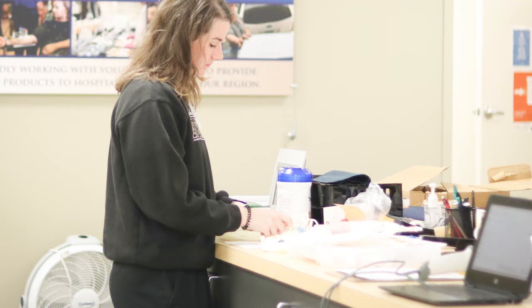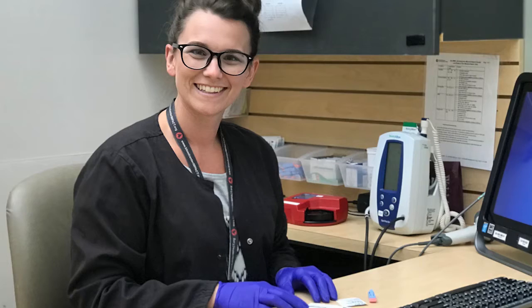Documentation is very important. If it's not documented, it didn't happen. It also provides us trackability, traceability for that unit collection. If something happens and we need to go back and review the overall donation collection of that unit, we go back and re-reference the documentation.